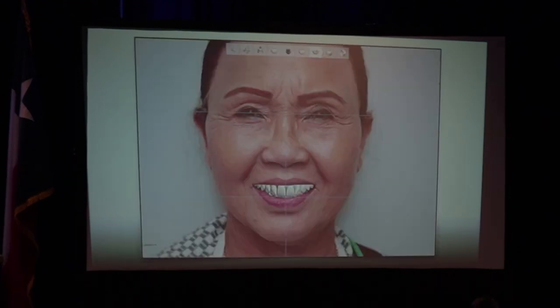Same workflow. Got a photo. Patient accepts the treatment. Show them your cases. This is what we can do. Over promise, over deliver. Going back to the same workflow, give the photo to the designer: hey, we're going to do an all-on-six on the upper. Small design process. This is it. This is what the designers do.